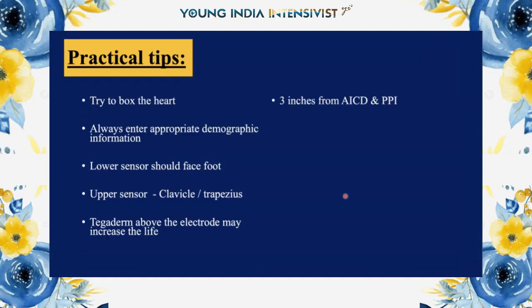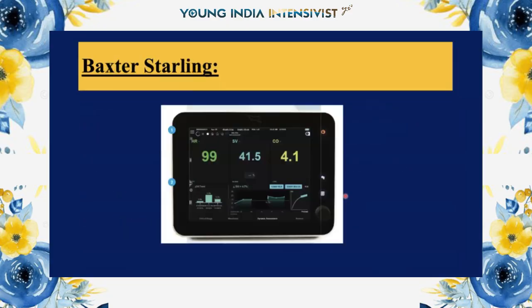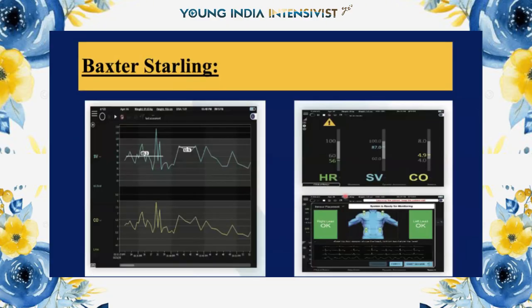Place the electrode carefully, as it increases the lifespan. If there are any electrical devices, always try to go away from them. Clean and dry skin is very important. Yes, you can do a chest X-ray or a CT, but MRI is not compatible.